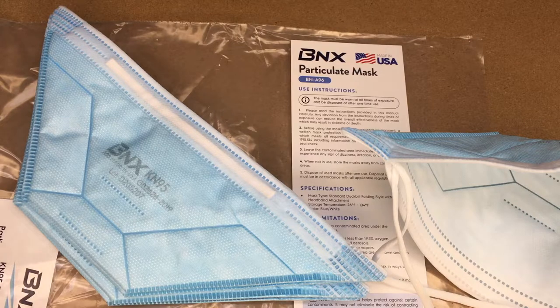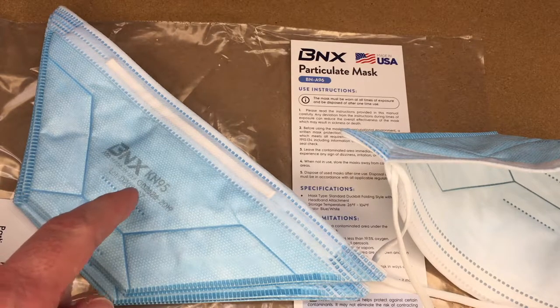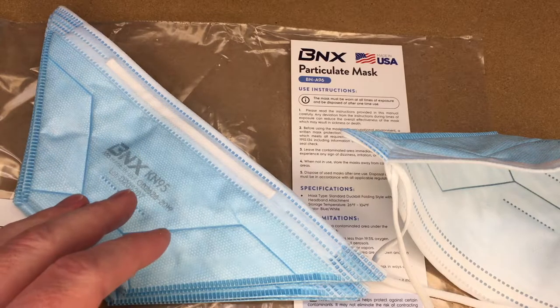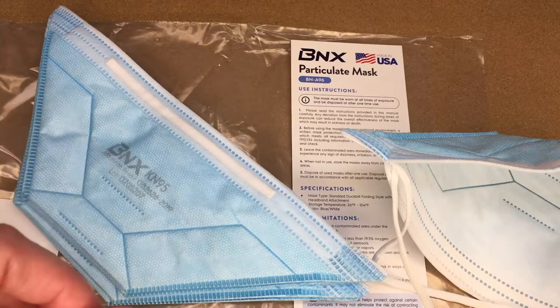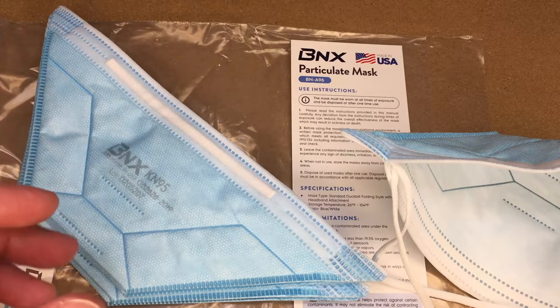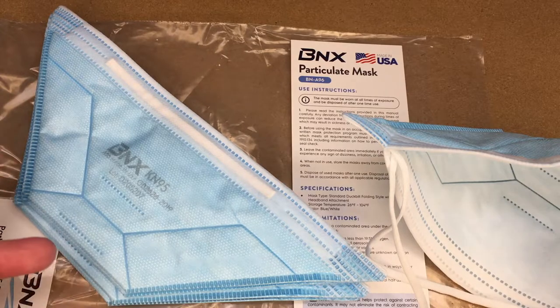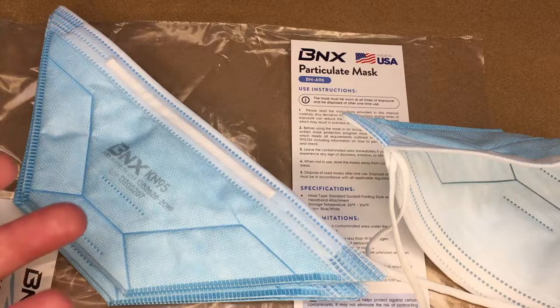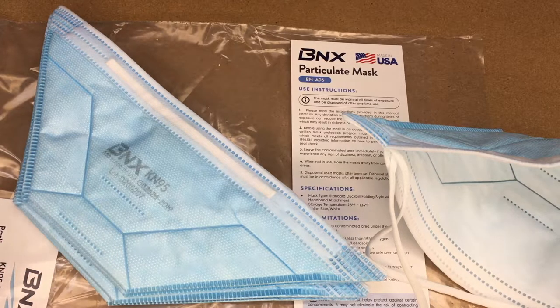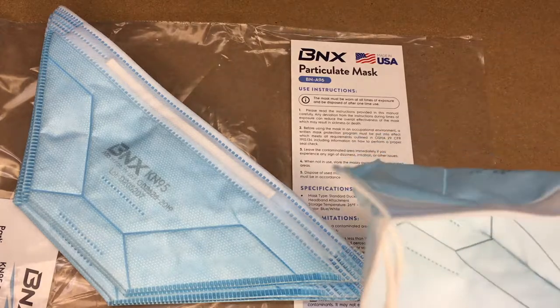I want to say I'm not a mask expert and I'm not a medical expert, so if anything I say sounds fishy, definitely Google it and research it on your own. From what I understand, a KN95 mask is similar to an N95 mask but it doesn't go through the same process of certification, so there may be certain environments that require an N95 where a KN95 wouldn't work. But if you can't find N95 masks, this could be a good alternative.